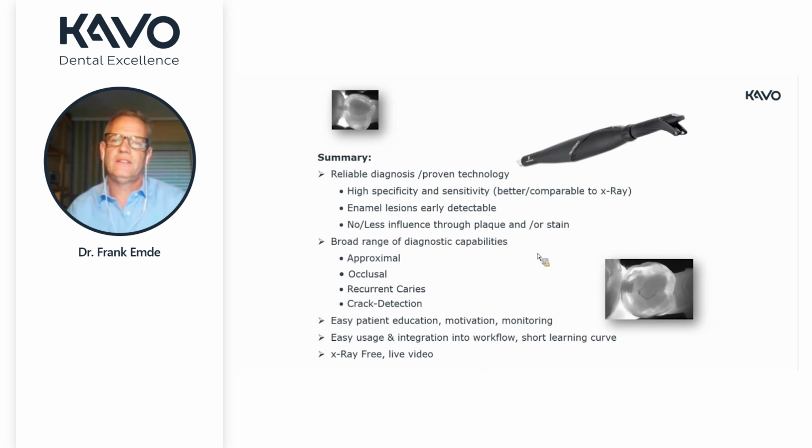Important is that there is more or less no influence through plaque and or stain. It is just, as I mentioned, a different technology. It's a technology which is not based on fluorescence, on the response of light. It's more a technology where we use this long wavelength, which can penetrate the tooth in a very good way and is not influenced by plaque or stain.